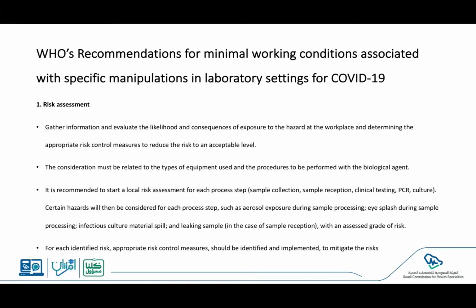So what I went through now are the basic laboratory requirements that each and every laboratory would really need to have to function as a clinical microbiology laboratory or as a research setting that is working on infectious agents.